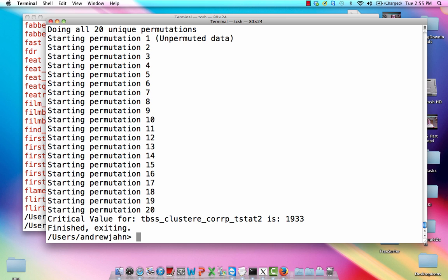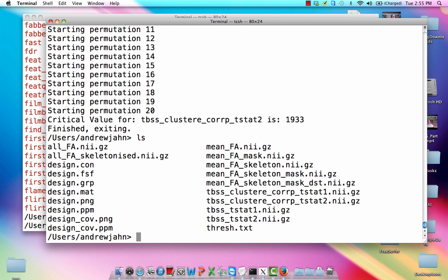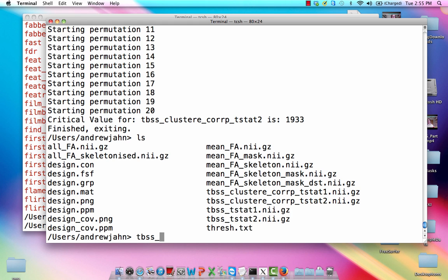So now we actually do have some cluster corrected maps. This TBSS cluster core PT stat 1 - this is that first contrast that we carried out where we're looking at younger folks as opposed to older folks and we're comparing their tractography. Where is the diffusion coefficient, in other words, significantly greater for one group as compared to another. So the last thing I would do, because if you just load that up, it's going to look like one voxel thick. It's just going to be projected onto that skeleton, which is just one voxel thick. And to make a nicer figure, we're going to be using TBSS fill.